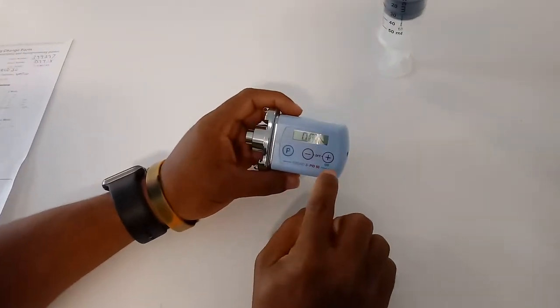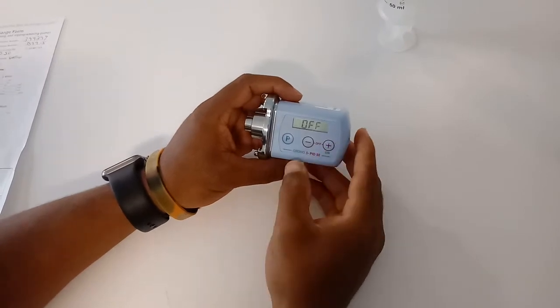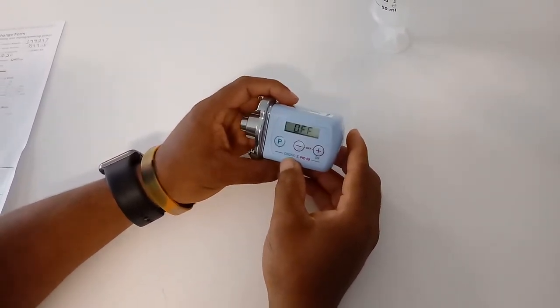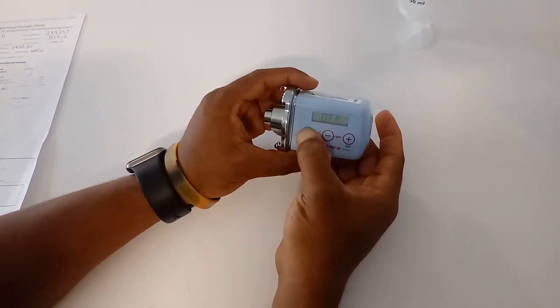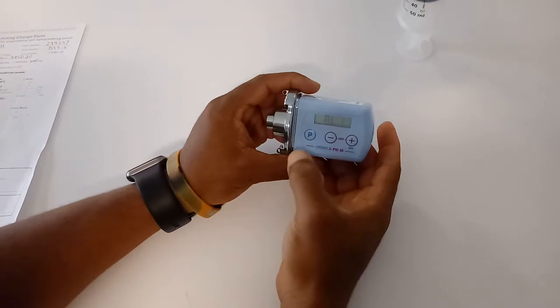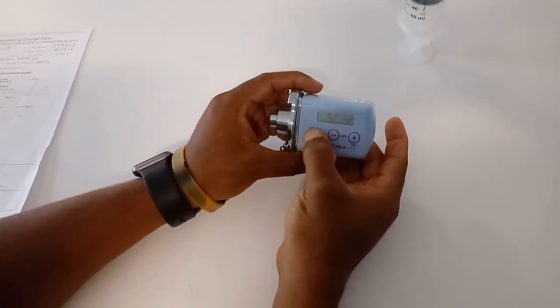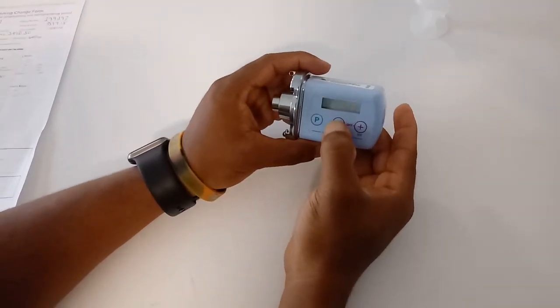And as you can see here, to turn the pump on, you have to press this plus button by itself. Right now the pump is in the off mode, so I'm going to now program the volume. So let's see here. I press the P, hold it down a little bit. Okay, at this point I press the P again.